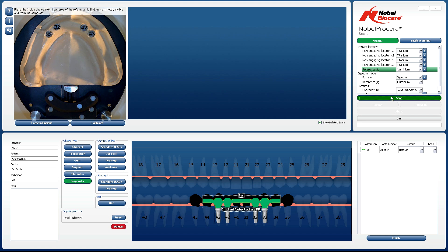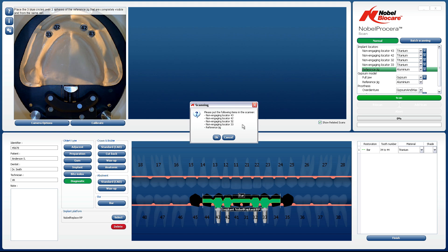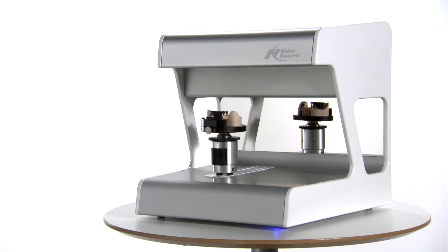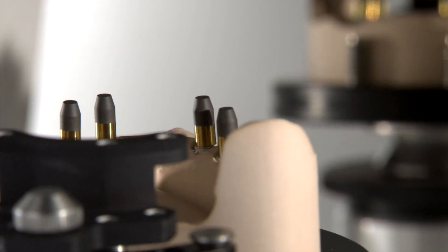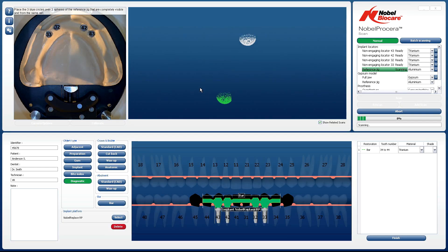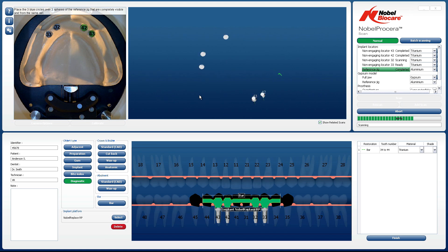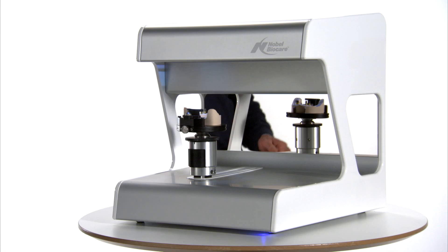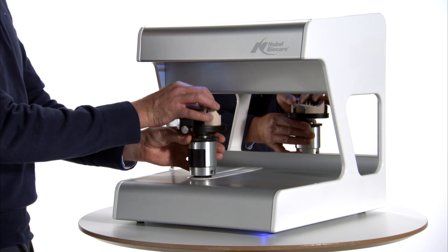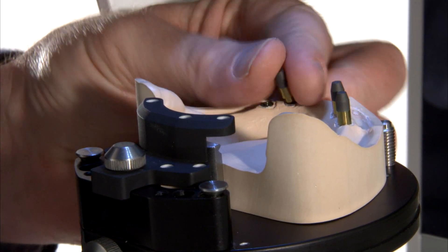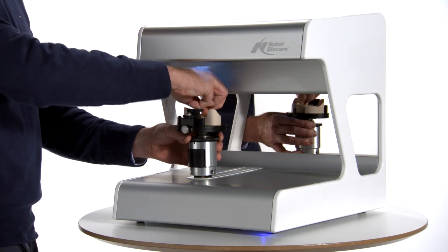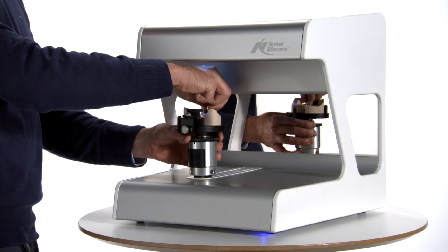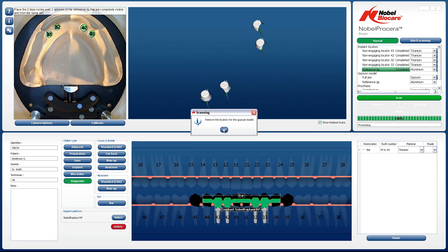Once Scan is clicked, a pop-up window will appear ensuring that the reference jig and position locators are in position. Left-click on OK to continue, and the scan will commence. Once the scanning has completed, a prompt will appear requesting that all model position locators need to be removed. Carefully remove the model position locators by turning them anti-clockwise. It is critical that from this stage onwards, the model is not moved independently to the model holder. When all the locators have been removed, left-click on OK.